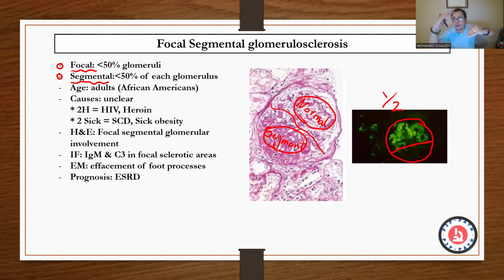And when you go high power, segmental. So focal, segmental. Focal means less than 50% of the glomeruli are involved, and segmental means less than 50% of each glomerulus is involved.